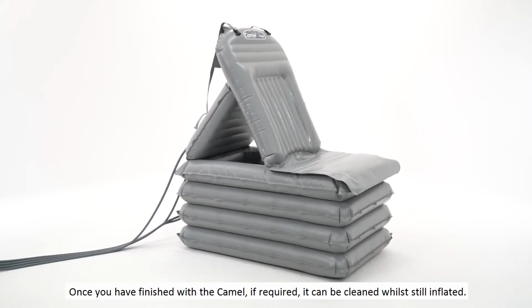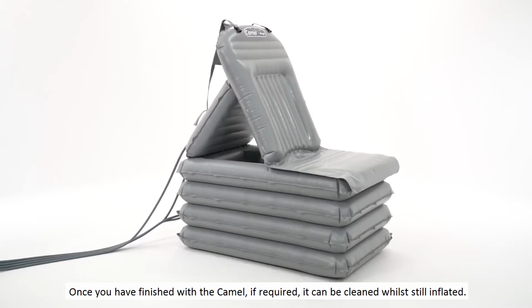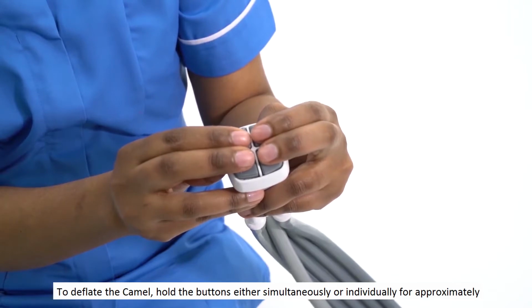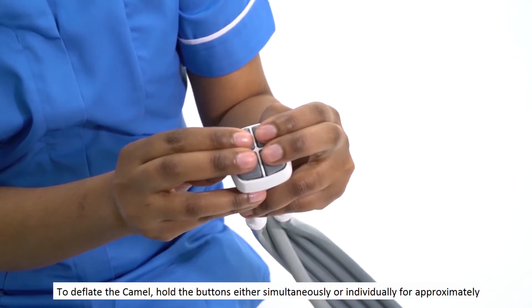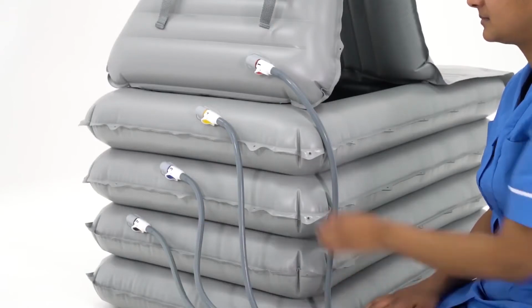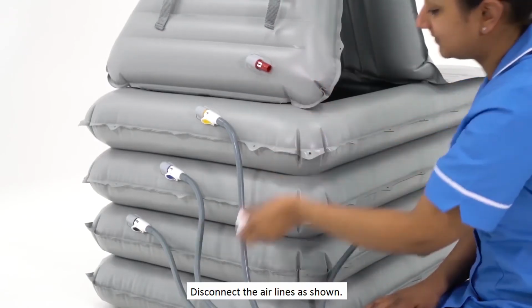Once you have finished with a camel, if required, it can be cleaned whilst still inflated. To deflate the camel, hold the buttons either simultaneously or individually for approximately 5 seconds to release the air pressure. Disconnect the airlines as shown.